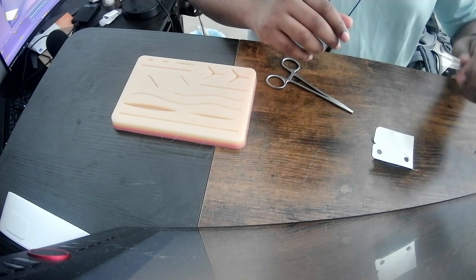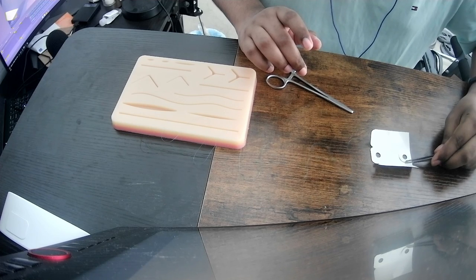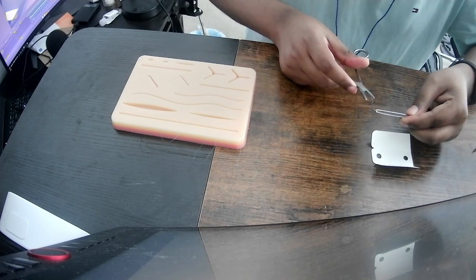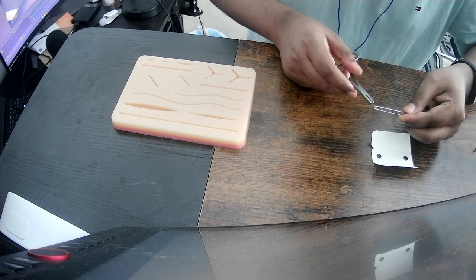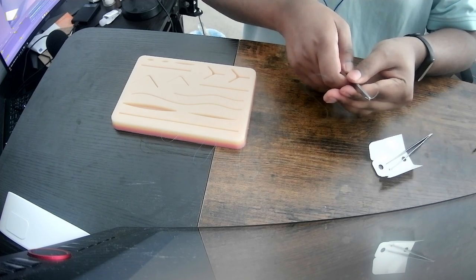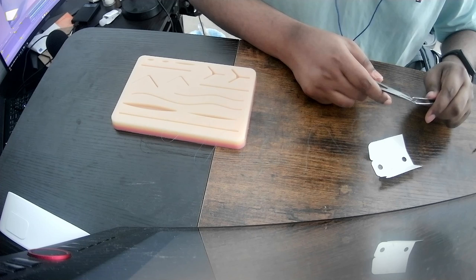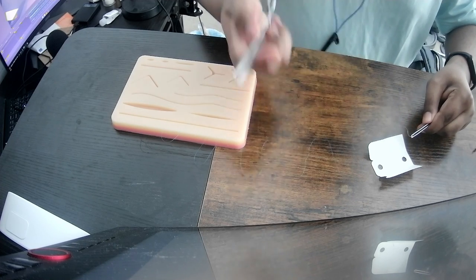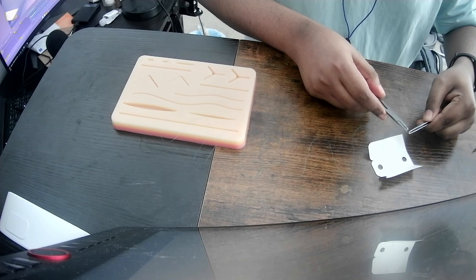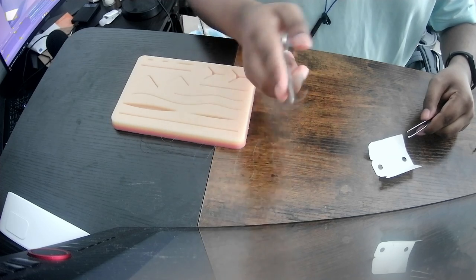Okay, making good progress. Let's load the needle again as I get ready. Very good. Now that I have an idea of where to load, picking it up is not too bad again. Let me try that one-handed, because I got scared at the end there. Let's try again. Okay, unlock. Prepare. I'm doing it right at the edge. And then lock. Okay, very nice and secure.